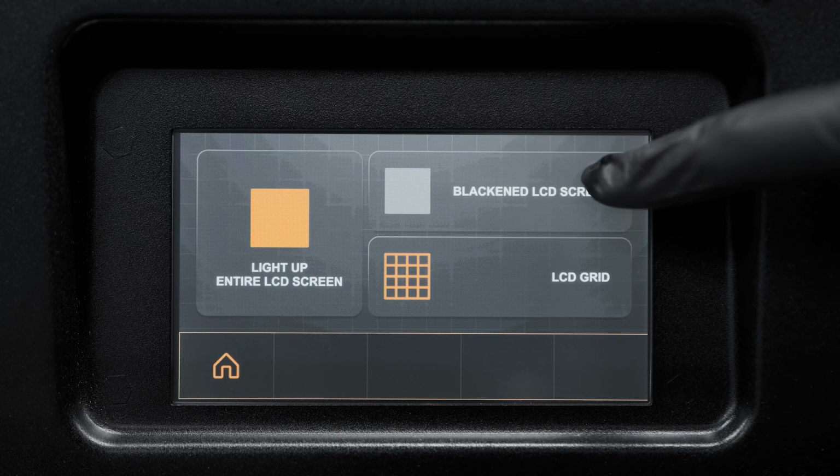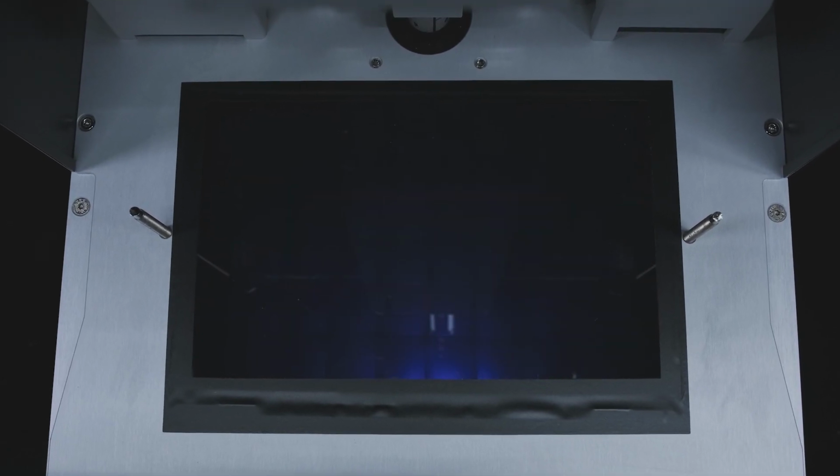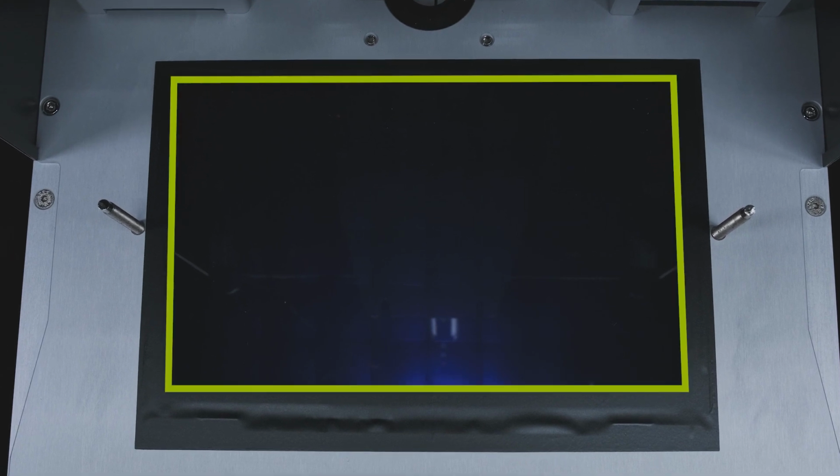Select Blackened LCD screen. The LED has to turn on under the LCD display, but the LCD does not have to light up, since the test is successfully completed only if the UV light is completely blocked out.